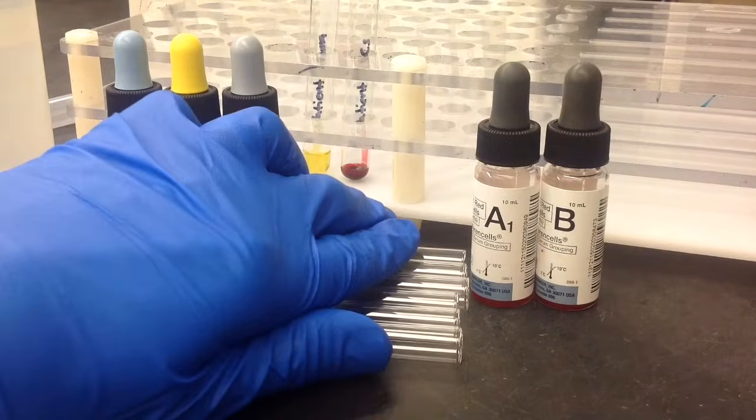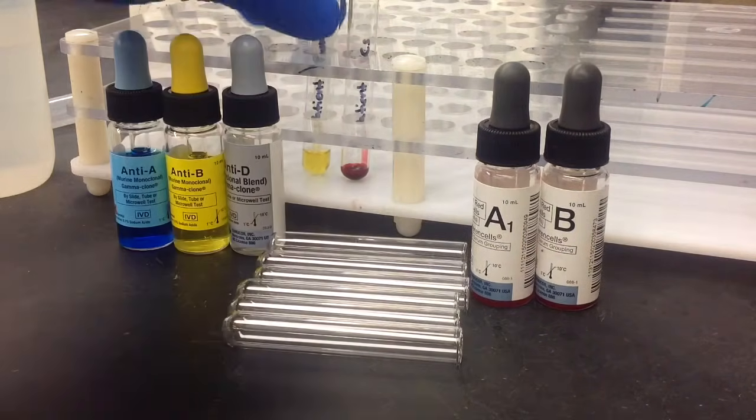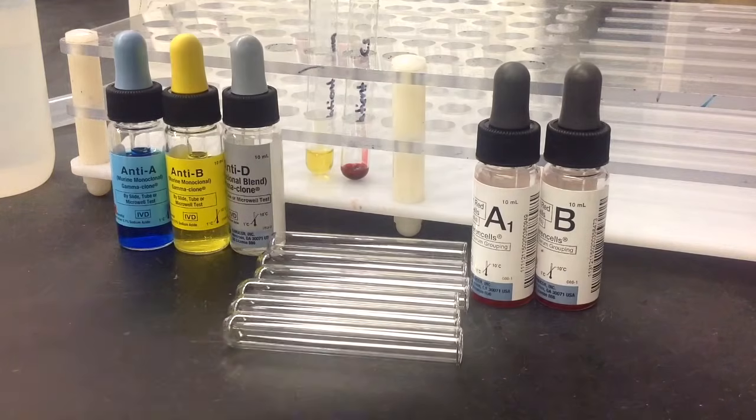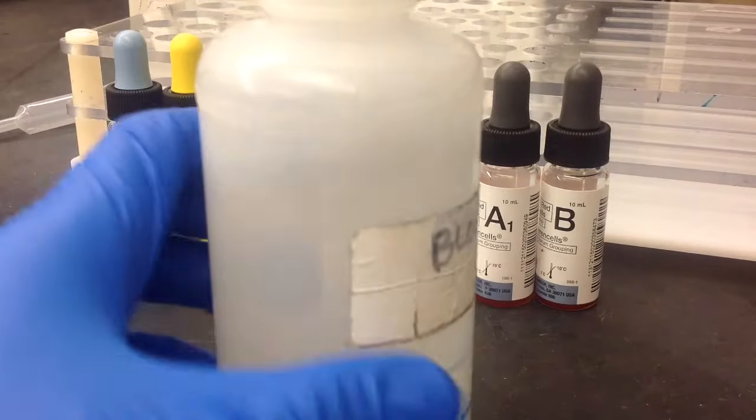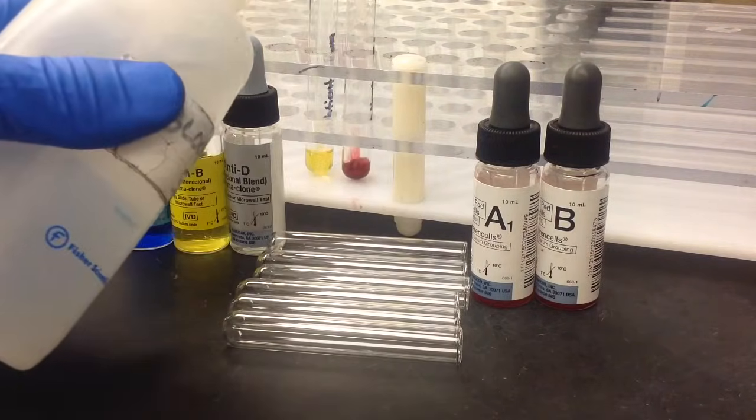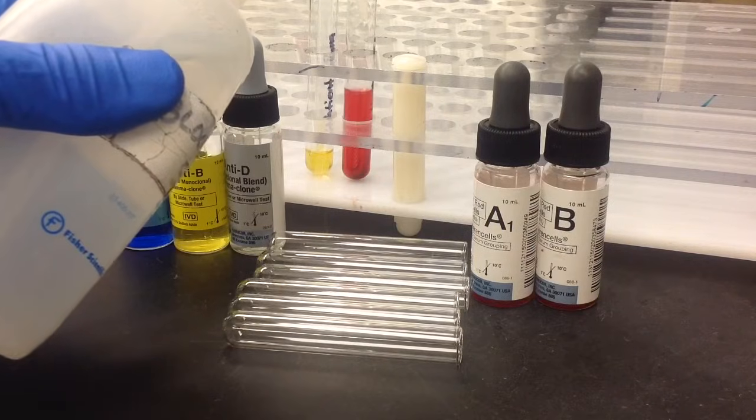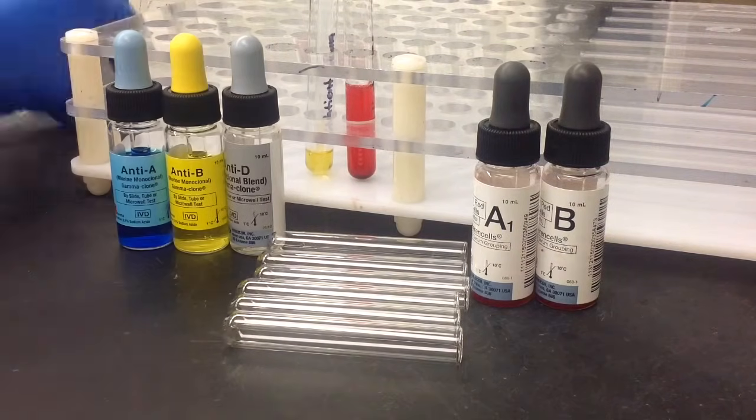And then you're also going to need some tubes, and some plasma, and some red cells. Now these are red cells that have been spun, so I need to make a suspension.